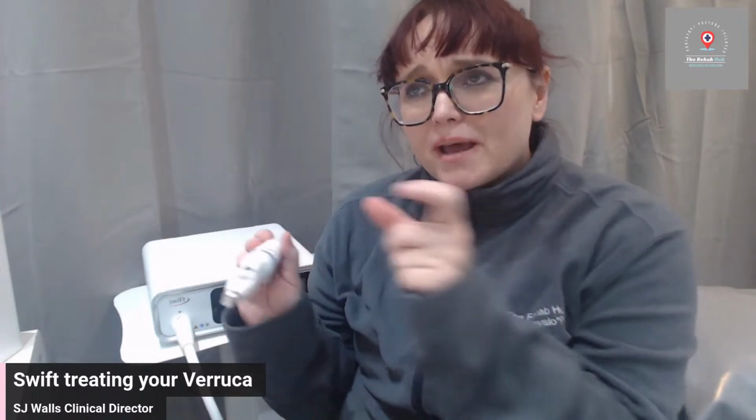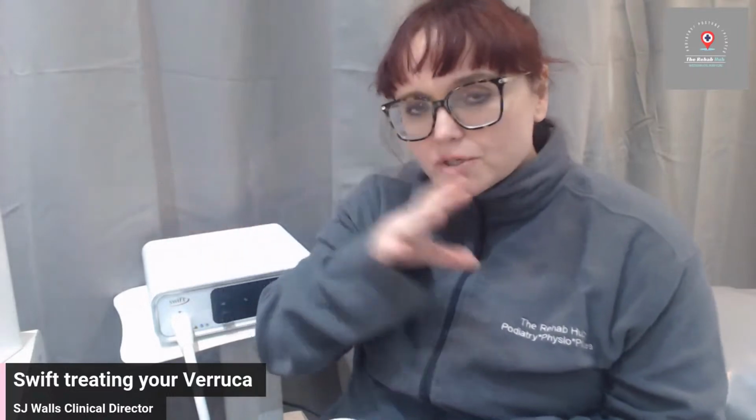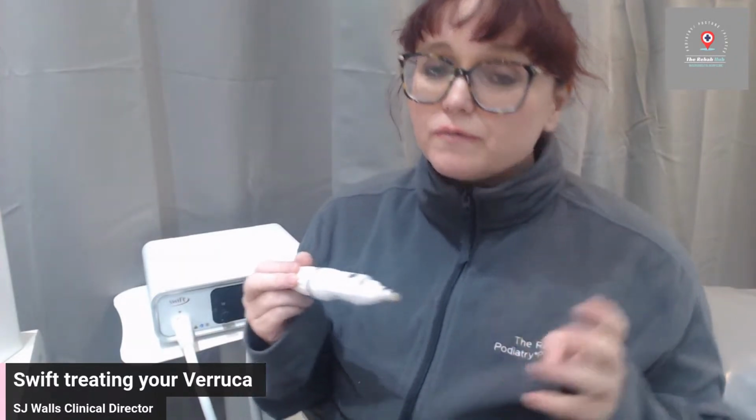Usually for kids, we'll try and get 3 in if they'll let us. And ideally 5, but 3 is a kind of good number. But usually we'll try and push it to 5, especially for adults. But we just see where that patient can tolerate it, because it is hot when it's on the tissue. You'll feel it hot, so it's like, oh, it's hot, and then it's gone. By the time you felt it, it's coming off.